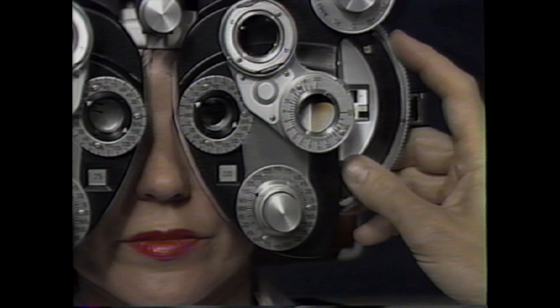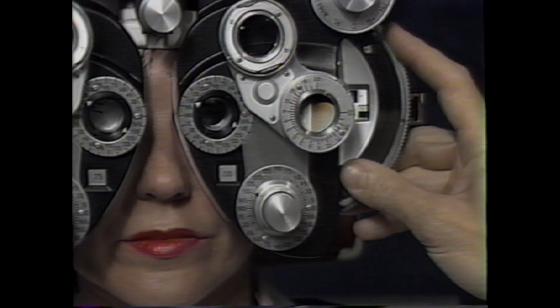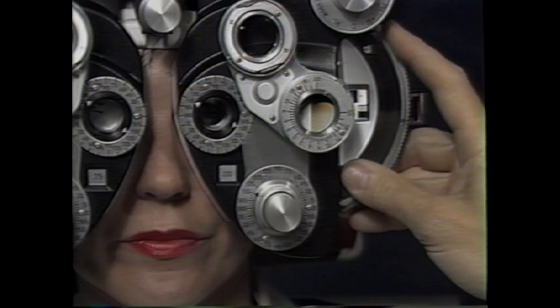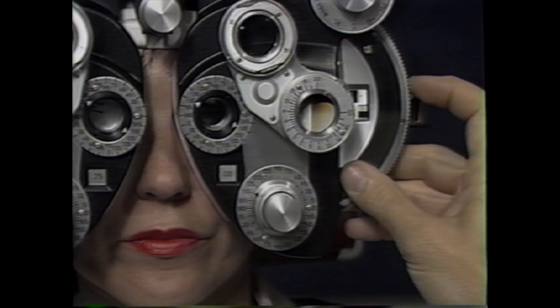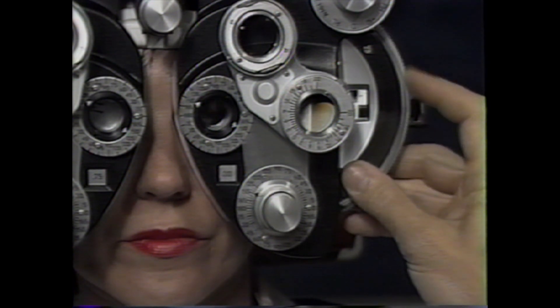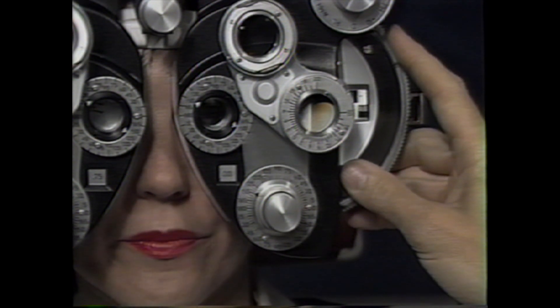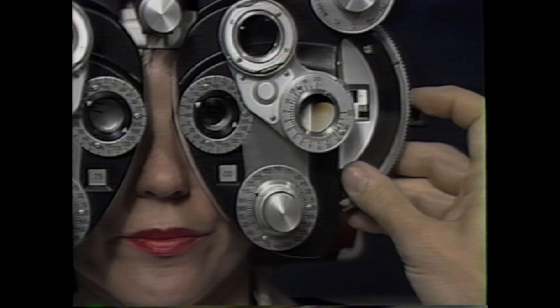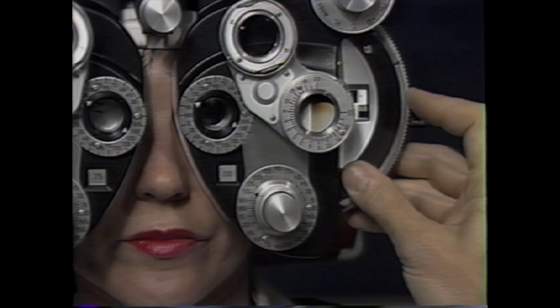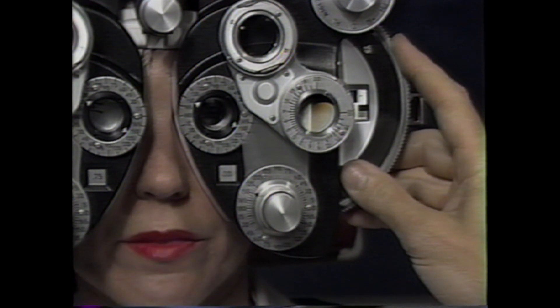Now watch closely. I'm going to change it. Does this make it better or worse? Ready? There. Worse. Let's go the other direction. Better or just smaller and darker? Ready? There. That's better. Again, still better or just smaller and darker? Ready? There. Better.